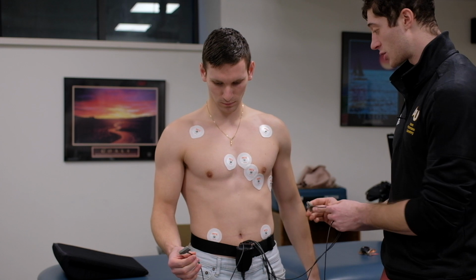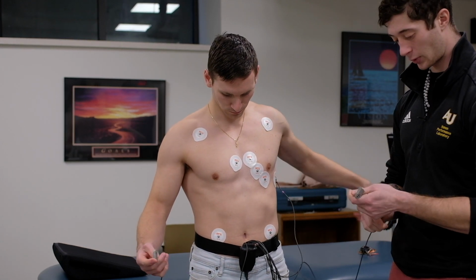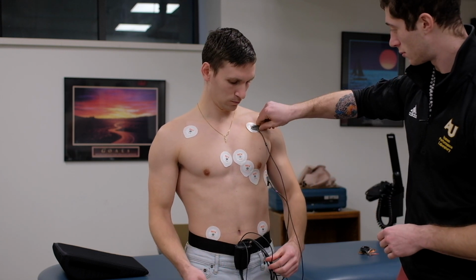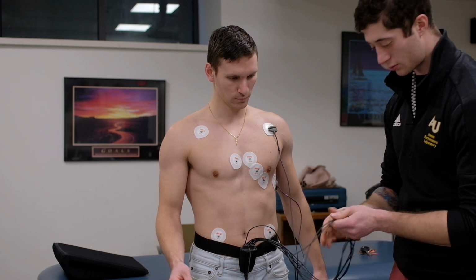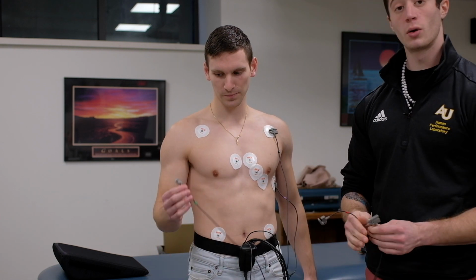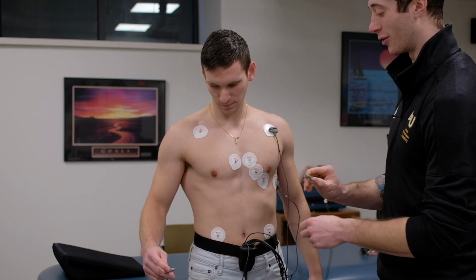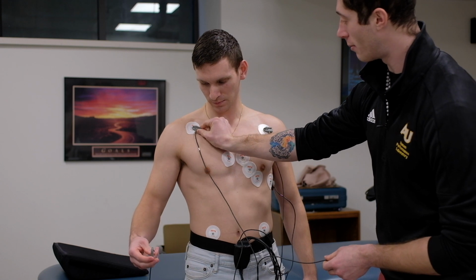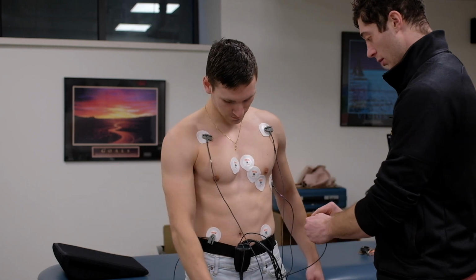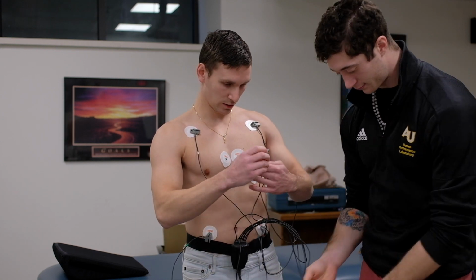This one says V6, therefore I'll place it on V6. Left arm. And Peter can help me as well. He knows where they go, but when you are working with someone, you make sure that you apply all of them. Right arm. Right leg. Left leg. V3.